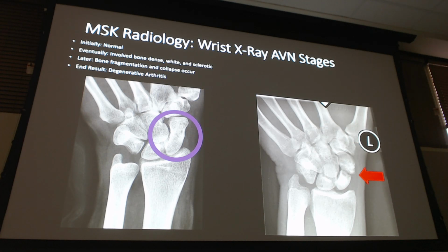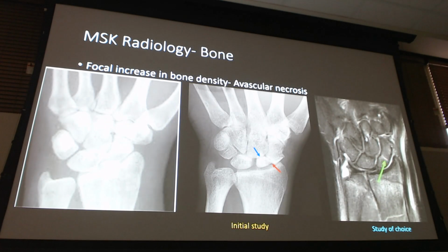Any kind of surgery or fracture, anything like that, is going to increase the risk of arthritis in patients. Especially these ones are going to be degenerative arthritis. And we'll talk about different kinds of arthritis today, and how to tell the difference between them just by looking at x-ray and patient history. But know that this is a surgery. They're going to have surgery on this if they fracture their scaphoid. Questions on this slide and that stepwise process? Okay. Here's some more pictures of it to give you an idea.